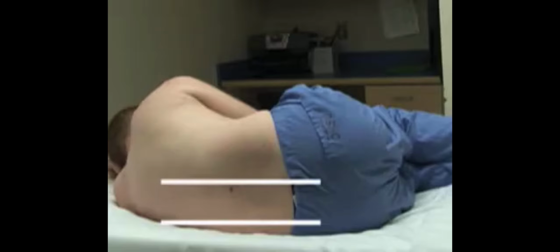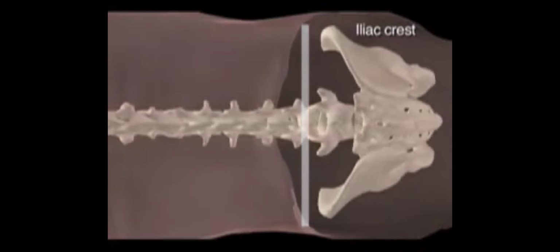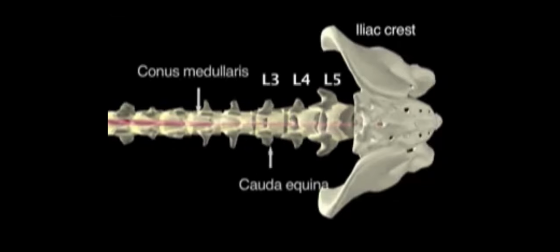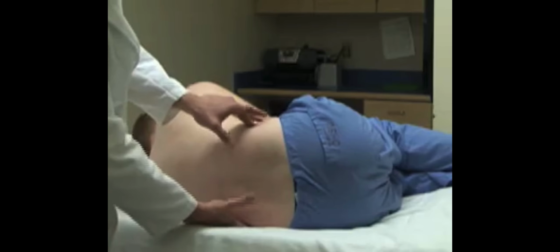He or she is in the lateral recumbent position. These positions help keep the needle at the midline. A line is visually drawn between the superior aspects of the iliac crest and intersects the midline at the L4 spinous process. Insert the needle in the interspace between L3 and L4 or L4 and L5, since this location is below the termination of the spinal cord.